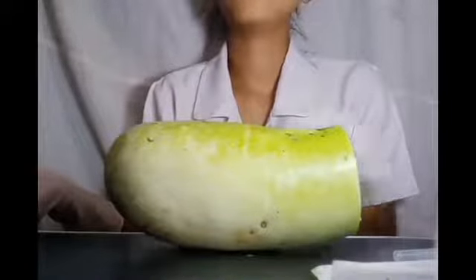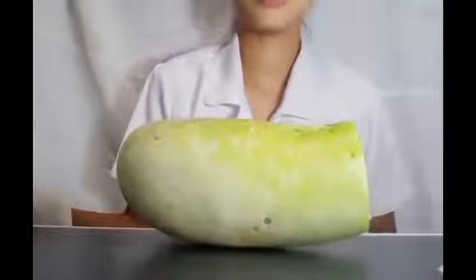Then at this point, you're going to wipe it. Wait for it to dry. Don't blow on it. Don't wave your hand over it. Just wait for it to dry.